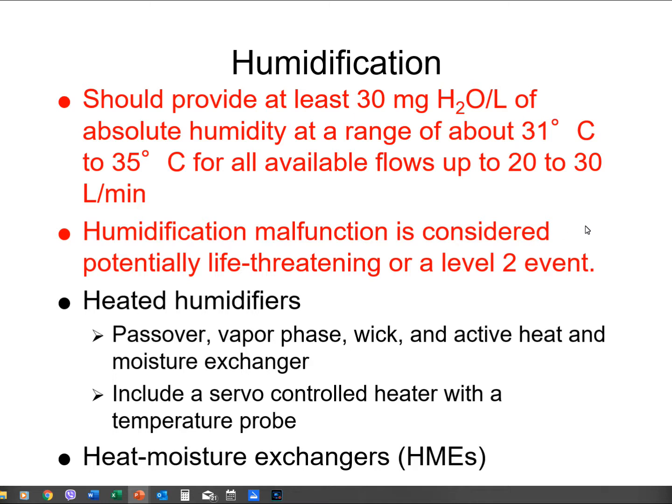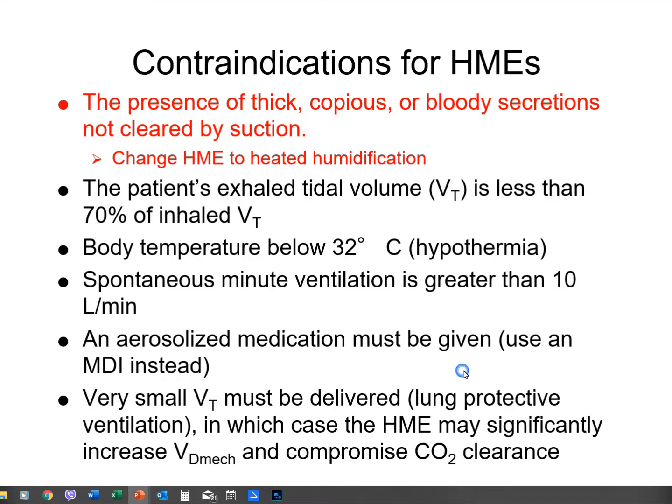But if the patient needs humidification for long periods of time, go with the heated humidifiers. The normal ones that we use is the wick humidifier. That's what we have at lab. Some people call them Fisher-Paykel's, and that's the brand that makes them. But normally they're called wick humidifiers.